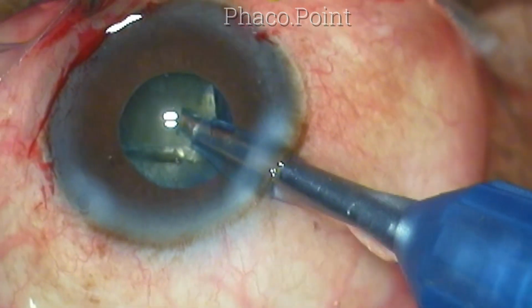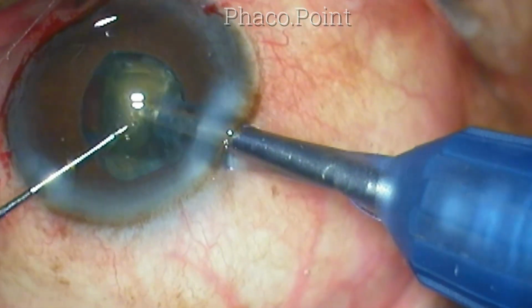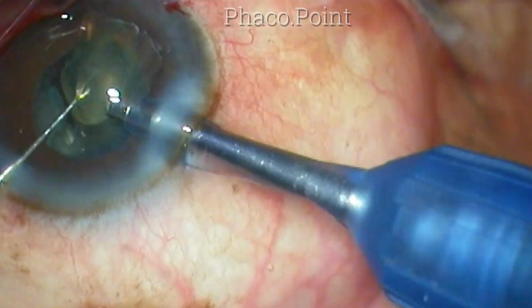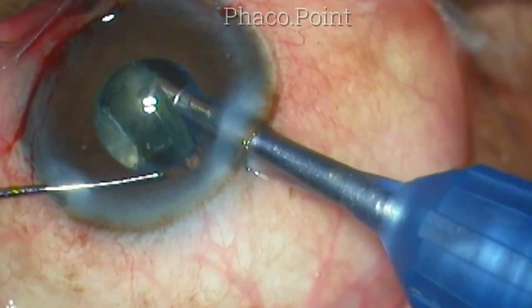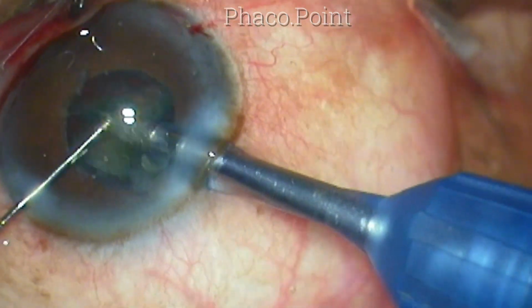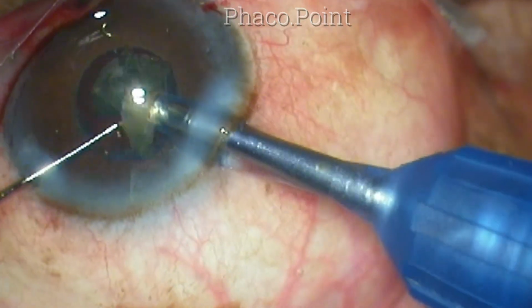At this point, once you've effected the crack, it's always better to exchange the sharp chopper with a Sinskey hook because it's easier to maneuver a Sinskey hook in the anterior chamber. If the right amount of aspiration flow rate and vacuum is set, then the nucleus fragments will come towards the phaco tip and you don't have to go chasing after them into the periphery, which is an important step in small pupils for phacoemulsification.